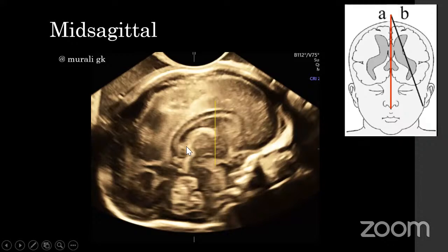This continues posteriorly and has a broad margin. Then just below the tela choroidea, you have the thalami, which continue imperceptibly into the midbrain. You can appreciate the tectum of the midbrain. Go down, you're appreciating the pons and its ventral belly. Just posterior to the pons, you find the cerebellar vermis. Another important structure where you can have fluid accumulation or a cyst is the cavum velum interpositum. This is found just at the level of the splenium.